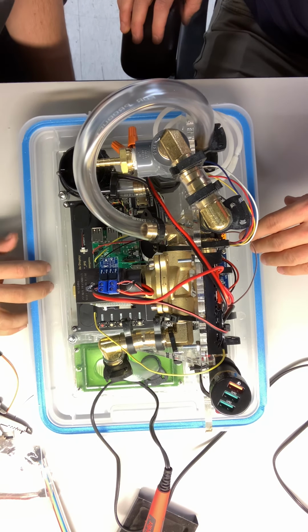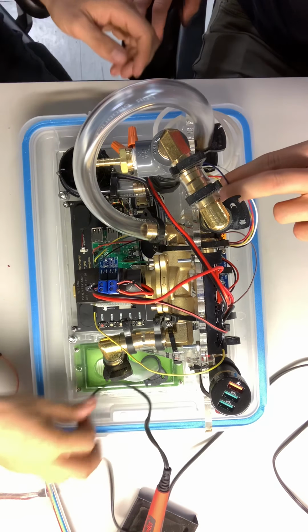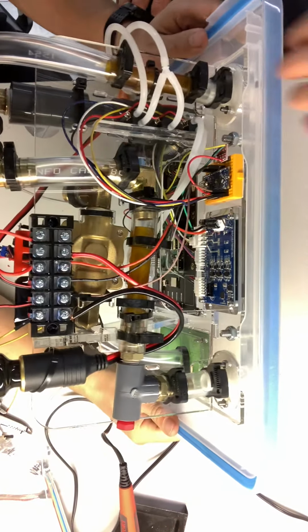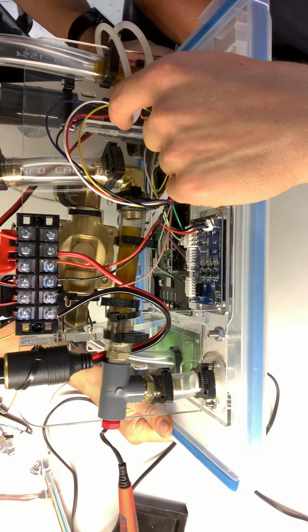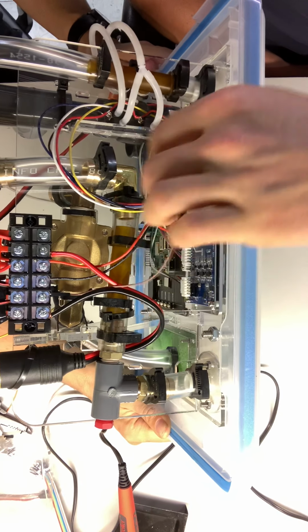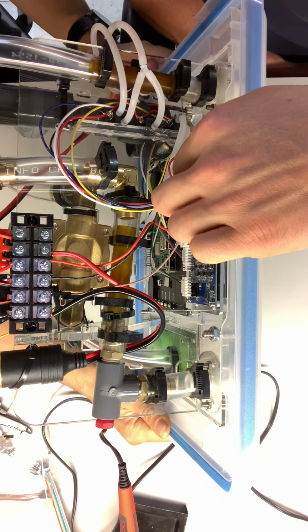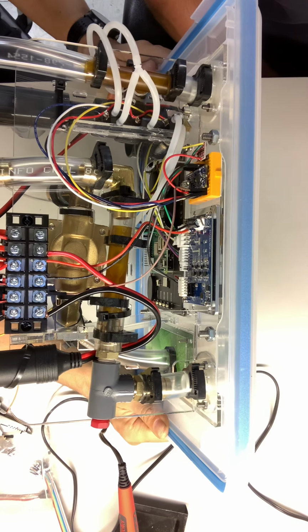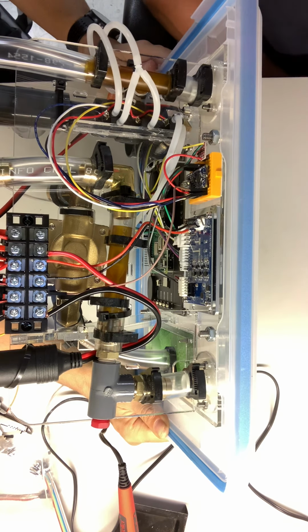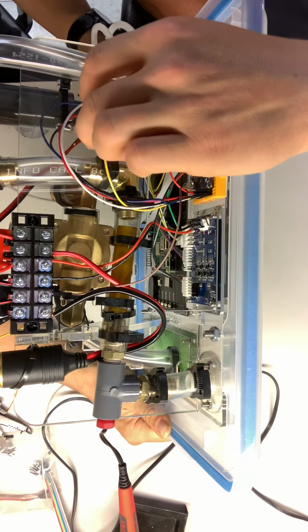Now let's check the signal wiring there. So we have blue. Yeah, blue is the exhale patient signal, differential signal, and that's going into, let's count, 1, 2, 3, 4, 5, the 5th pin on the Arduino. So we got 1, 2, 3, 4, 5. Cool. The next one to that is yellow, which should be pin 6.